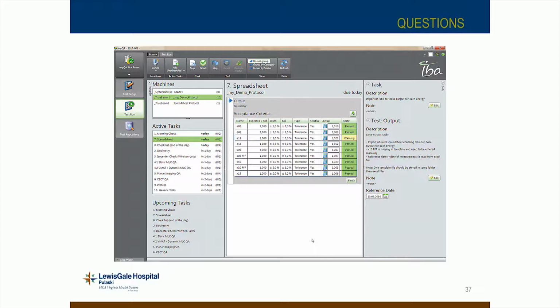And for me, the biggest thing is having the queue set up, those test templates set up on a time schedule, right? So every time I open up the Machines module, it lists my machines. It lists what tests need to be done, and if you get to the 28th of the month and it still says you have 32 tests left on your 2100 IX, guess what? You're probably not going home early that night.